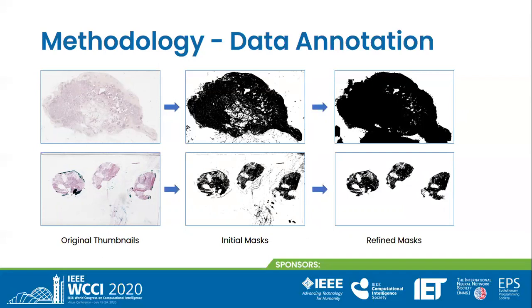At this step, dilation was performed on difficult cases to make sure all tissue parts are preserved. Finally, each pair of mask and thumbnail is resized to make each dimension less than 1024 pixels to make the images small enough to be fed to the network.